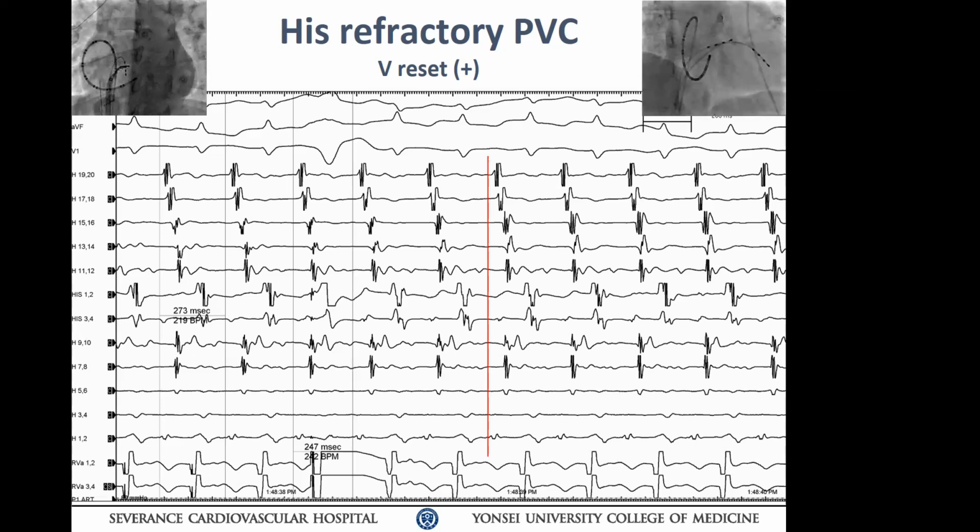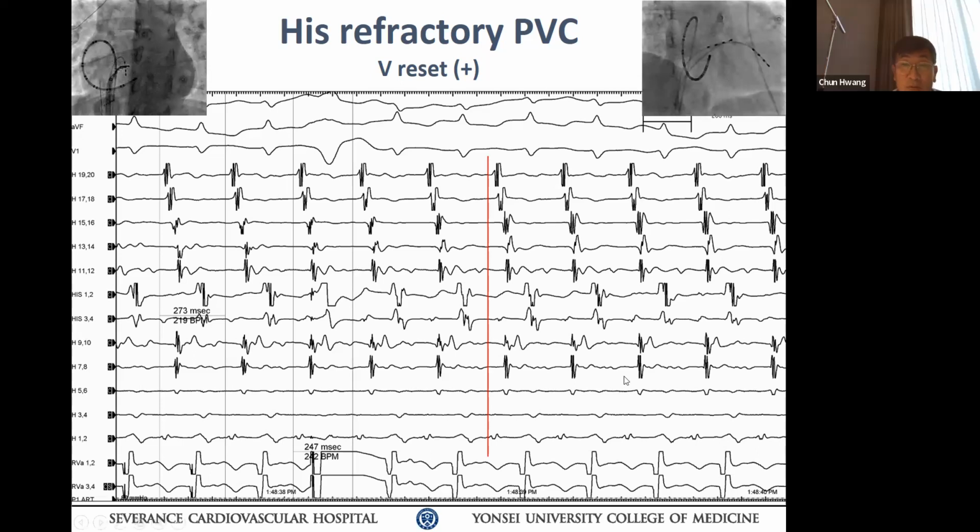언제 레프트 사이드 세프톤을 타고 올라갈 가능성이 많은 것 같습니다. Oh, what? You had the left side posterolateral pathway. You burn the proximal section of that thing. Distal portion is live, coming through the Bachmann bundle. Is possible?